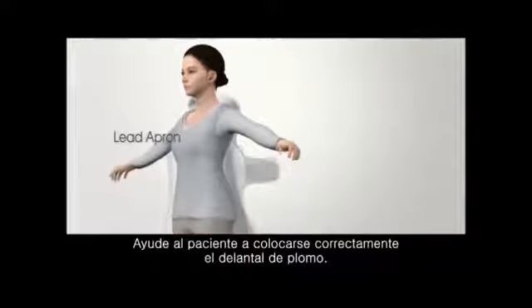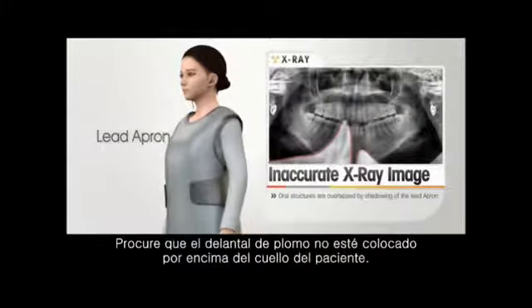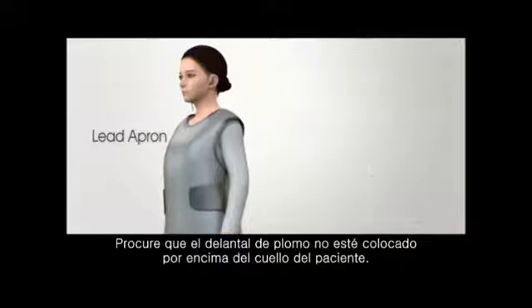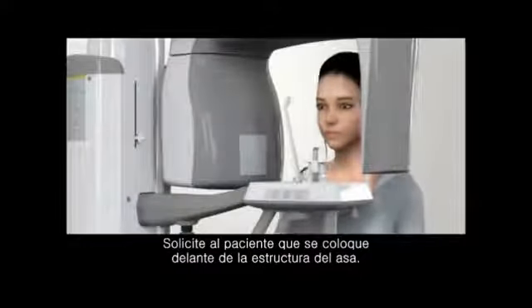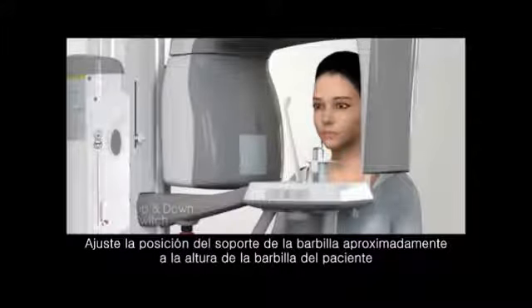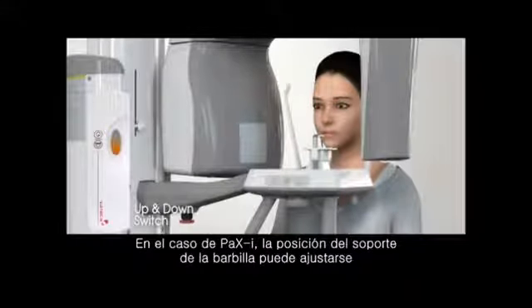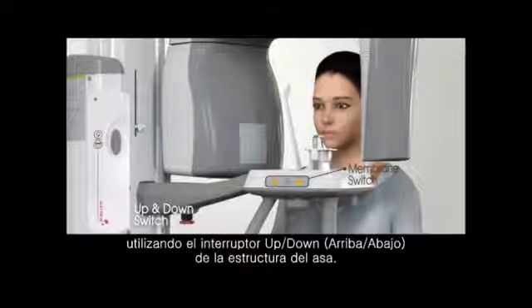Assist the patient to appropriately wear the lead apron. Be careful the lead apron is not above patient's neck. Ask the patient to stand in front of the handle frame. Adjust the chin rest position approximately to the height of patient's chin using the up-down switch. For Pax I, the chin rest position can be adjusted using the up-down switch on handle frame.